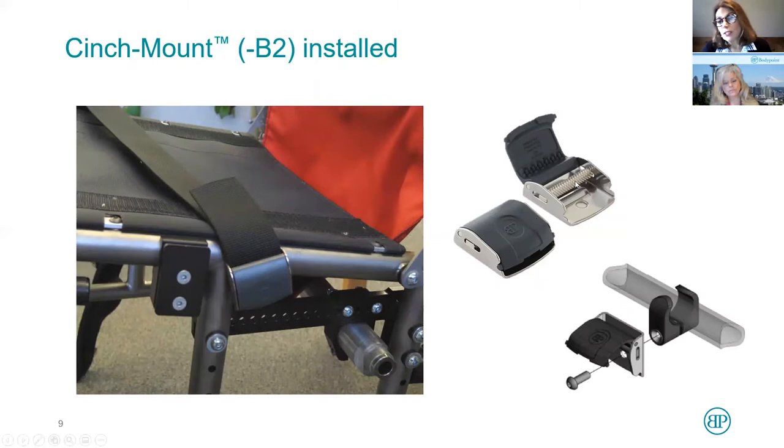Here's the cinch mount in a bigger picture where you can see how it's quite different from a cam buckle. You see this knurled bar, which provides texture against the webbing. There are also teeth in the top of the cinch mount. When you thread the webbing through, adjust it to the length you need for your client, and close it — you'll hear an audible click. You know it's quite secure, and this cinch mount will also pass the standards for postural supports.